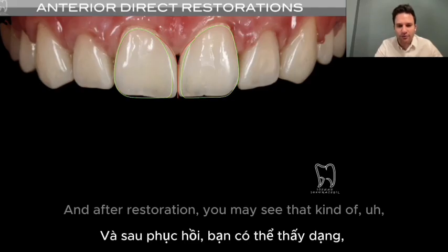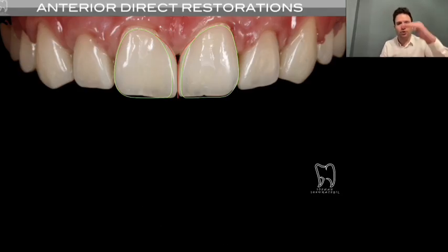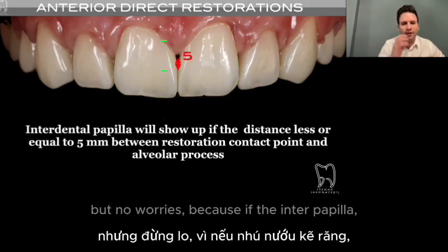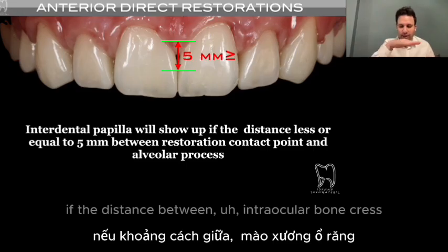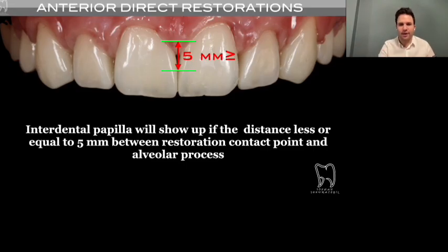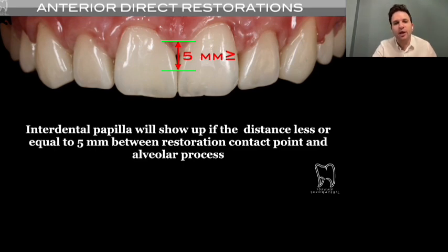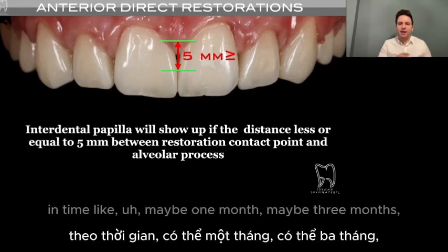After restoration, you may see a kind of black triangle, because the rubber dam directly pushes the gingival area. But no worries, because if the distance between the interalveolar bone crest and the contact point is less than 5 millimeters, the interpapilla will show up in time, maybe 1 month, maybe 3 months.